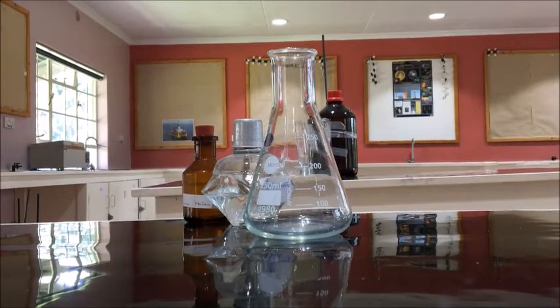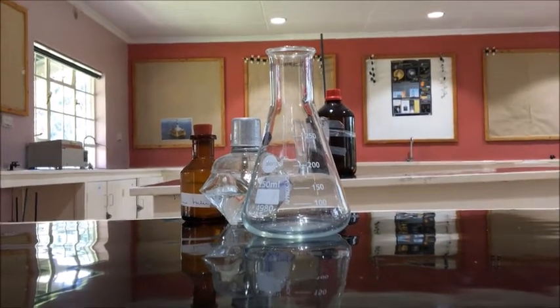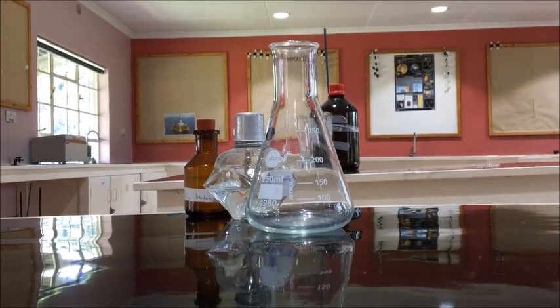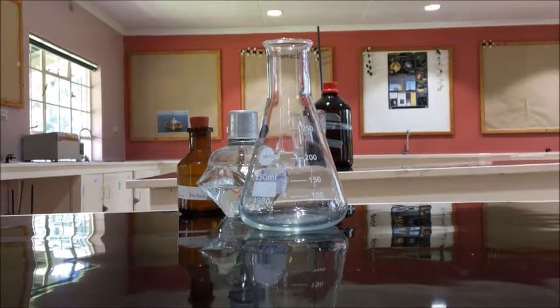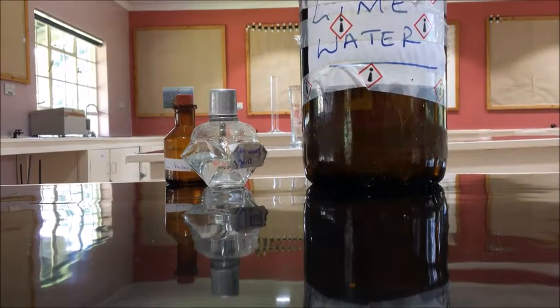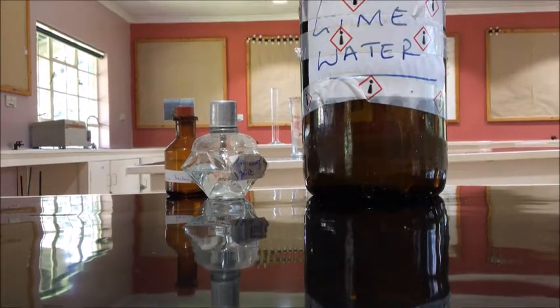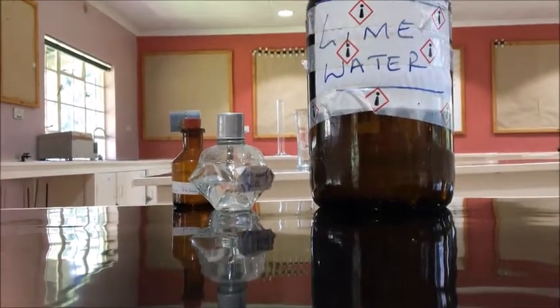So a shadow image is a little bit like this, except it's a little better than a shadow because you can see things that are behind, as long as the things at the front are not too dense. With that in mind, let me do another quick rearrangement. I've rearranged the items again, and this time I put the lime water at the front, and the lime water container is rather dense. You might consider it something that's absorbing a lot of X-rays, and that doesn't mean to say there's nothing behind it.